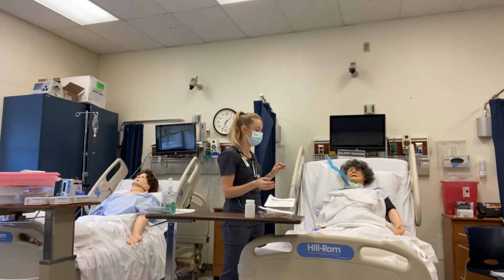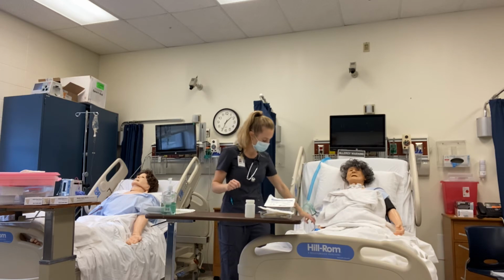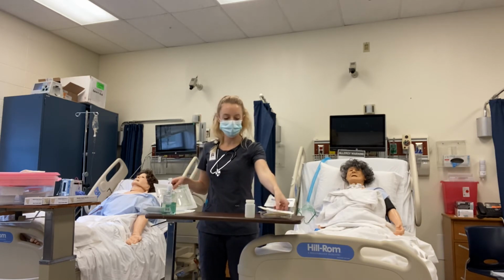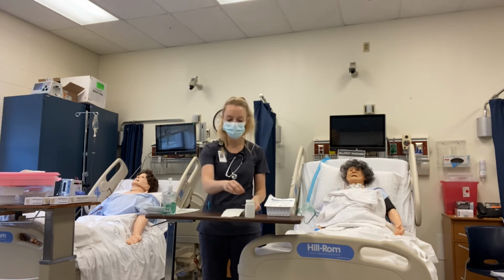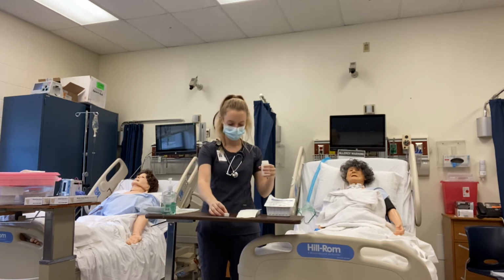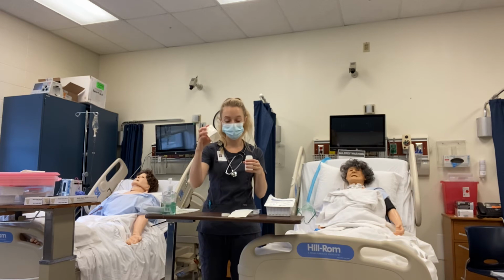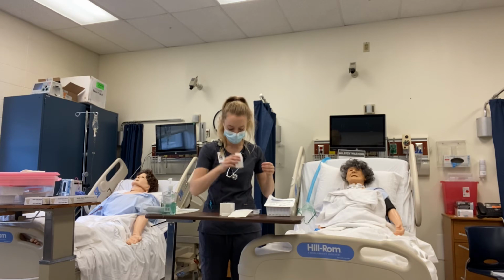Now that Mrs. Jones is almost ready to go, I'm going to take this off before I put on my sterile gloves and make sure that I have my suctioning here ready to go. I'm going to have my suctioning care kit here first, which I will go ahead and open. And I'll go ahead and open my saline as well. And I can go ahead and put the saline in my little container here.